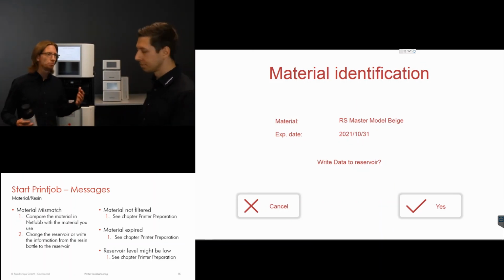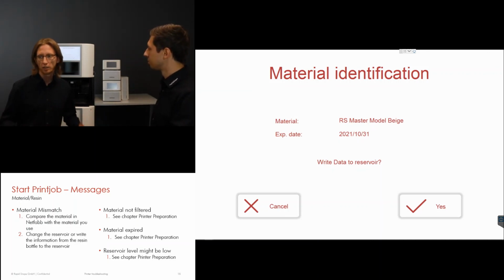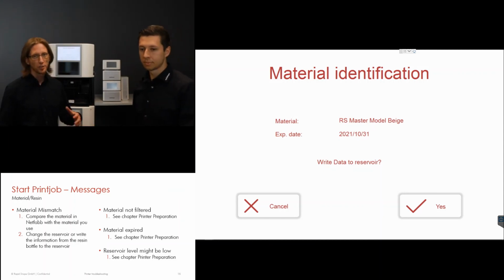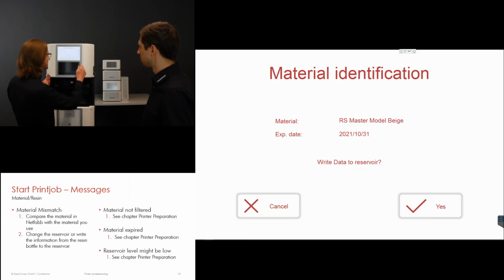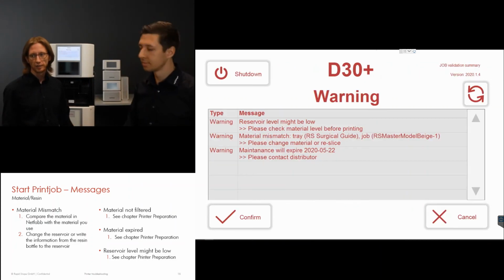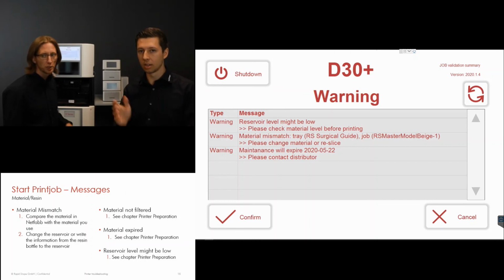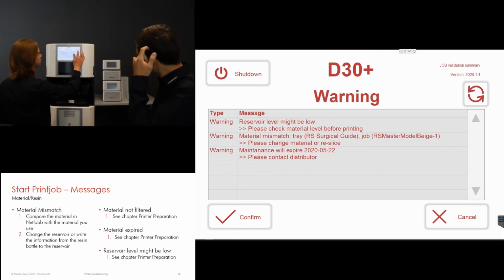So the material bottle was identified as RapidShape Master Model Beige. And we can also see the expiry date of this specific bottle. And now I just want to write the data to the reservoir, and I use the button next, sorry. So now it is written on the reservoir, and as on the previous slide, I would just like to use the button refresh. Exactly. To see what we got here.